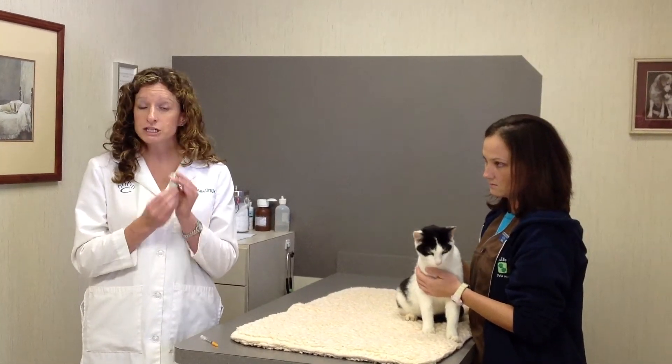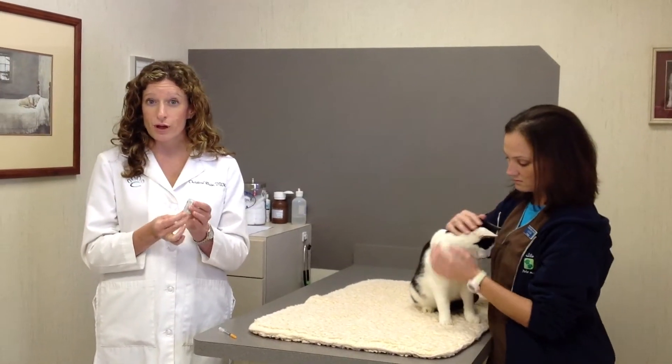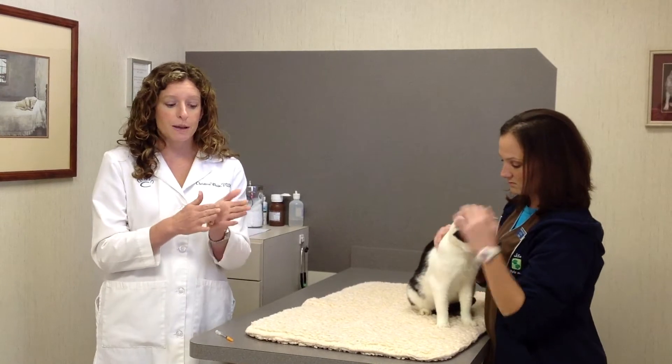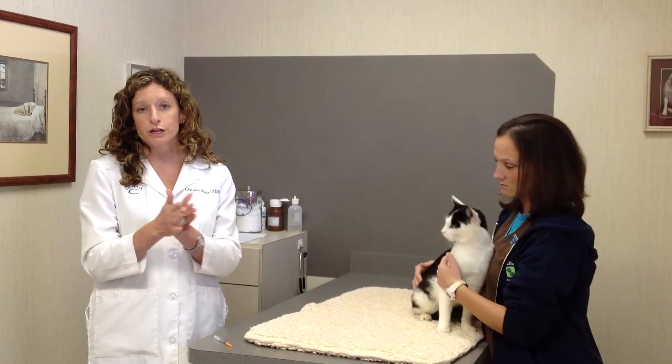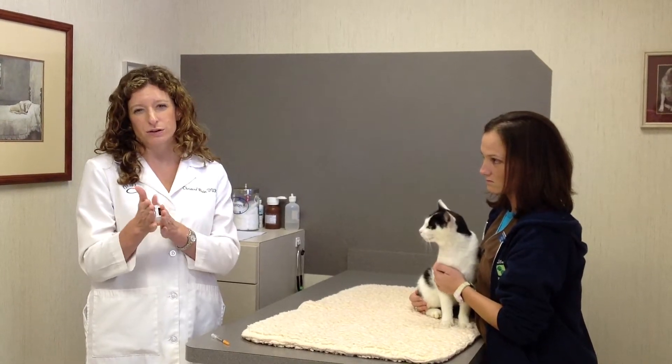First, you need to get your insulin out of the refrigerator. That's where you want to store your insulin to prolong the shelf life. You should mix the insulin by rolling it in your hands. You don't want to shake the vial, but you do want to mix up the contents, which may have settled.